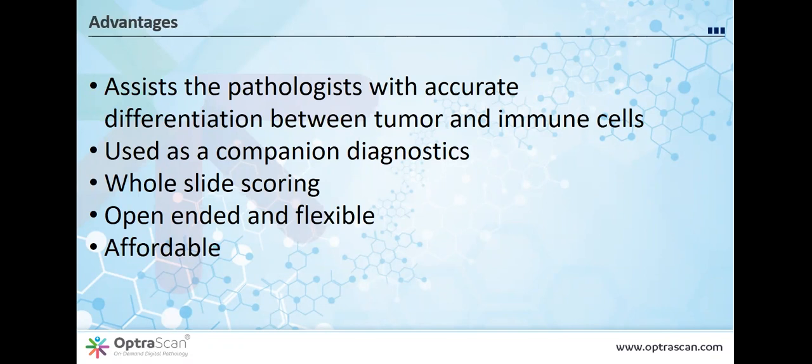The second advantage is also its whole slide scoring method. Many a times, pathologists tend to miss certain critical areas while scoring the slide manually, and this could have huge consequences. And in order to avoid that, the whole slide scoring method ensures that all of the slide has been looked at and analyzed to present accurate outputs. This tool is a great aid, and again, it is never developed to replace a pathologist.